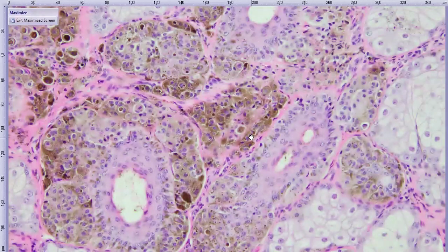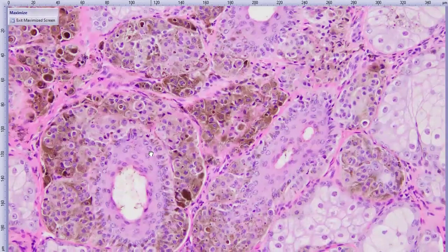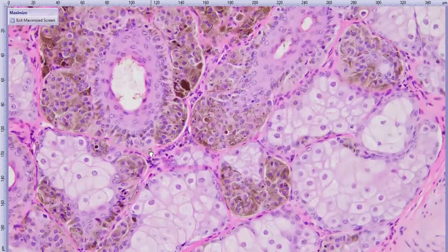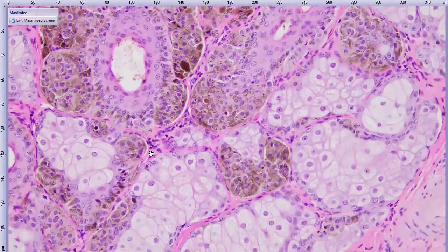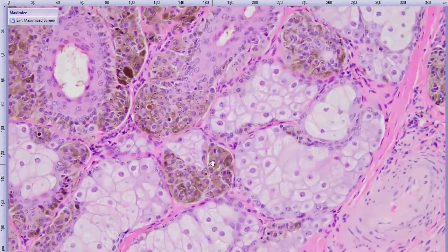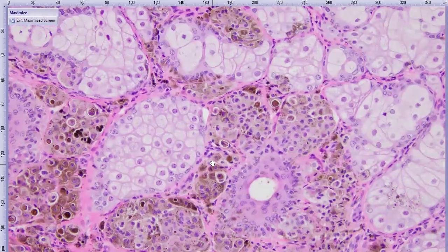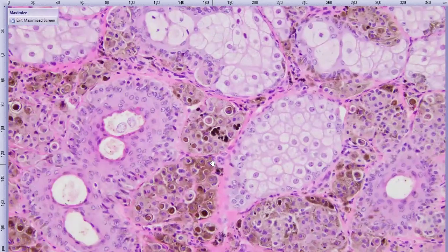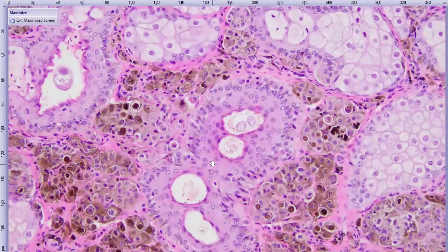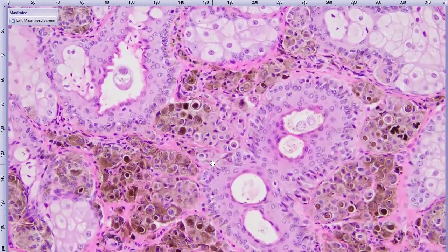Kind of surrounds the gland, and then they also start to infiltrate into the epithelium of the ducts of the gland here. So they're polygonal, with indistinct cell borders, moderately pigmented, round to oval nuclei, finely stippled chromatin, no real mitotic figures, but there is epithelial involvement. So I think he's got a benign melanocytic tumor as well, so melanocytoma here in the eyelid.